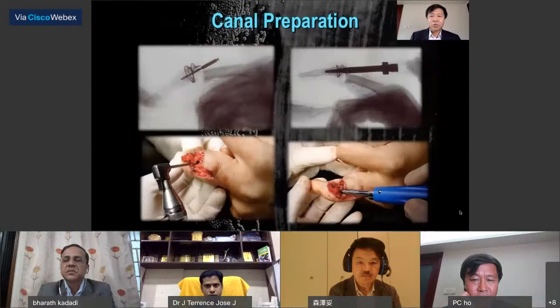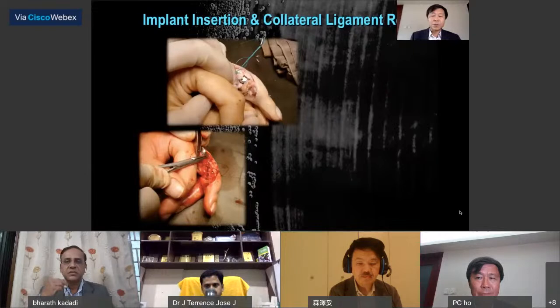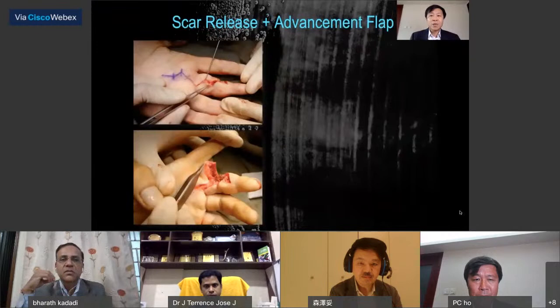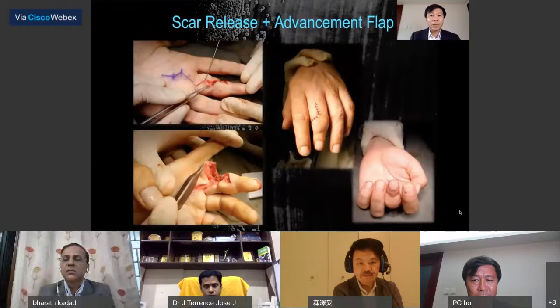Finally, we inserted the implant, fortunately without too much difficulty, and then we used some soft tissue of the FDS as a collateral ligament reconstruction. And still it's not the end of surgery. We worried that the soft tissue would not be sufficient, so we carefully released the scar and the flap, and fortunately, the skin was enough to cover the wound without the need for using a distant flap. And at the end, it was quite decent looking. So actually, the patient was very happy about the result.